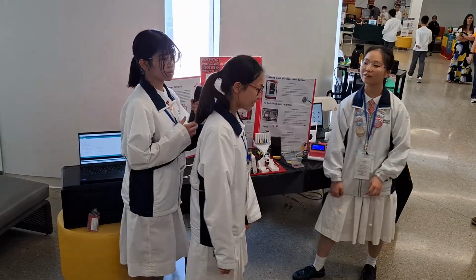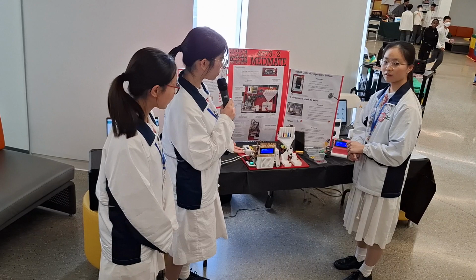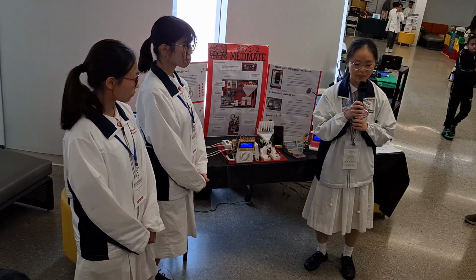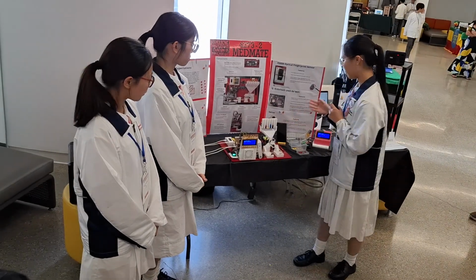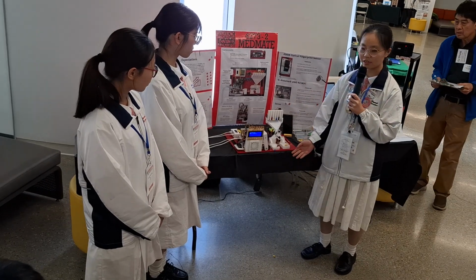Now, the machine will start to distribute the medicine. Please wait. The fingerprint is recognized and the distribution of medicine will begin. The pills that do not need to be cut will be distributed to the right-hand side, and the pills that need to be cut will be distributed to the left-hand side.